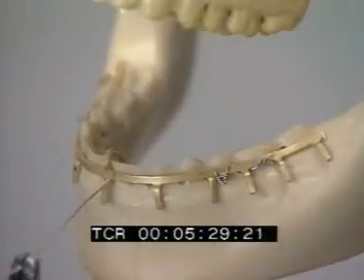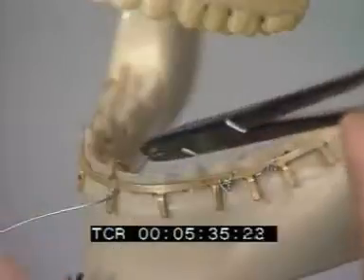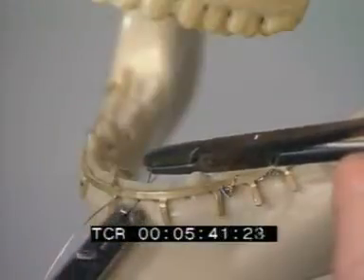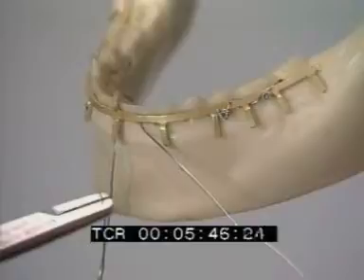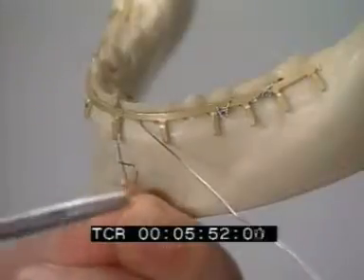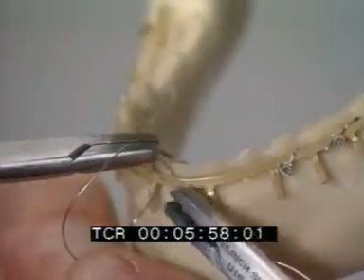In the frontal and canine regions, a loop ligature is used. The wire is first passed below the splint. Then one end is bent back and looped around the bar. Both ends are kept below the bar. This technique allows ligatures to be affixed to teeth that have almost no equator.